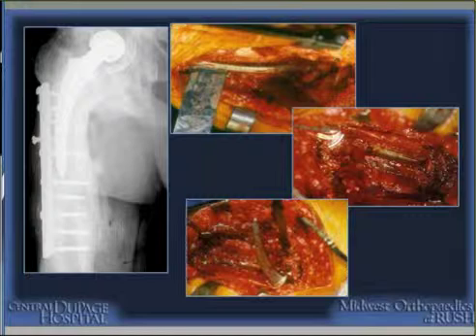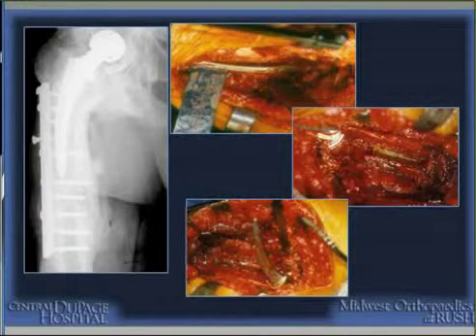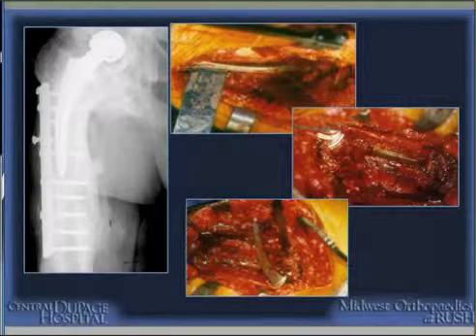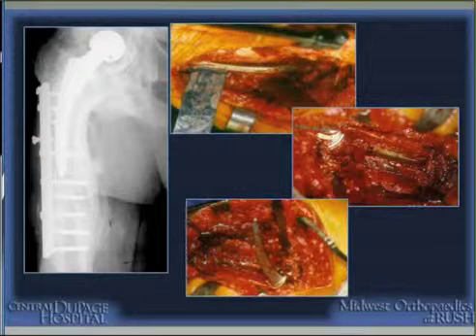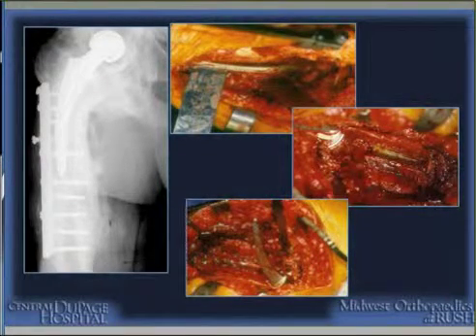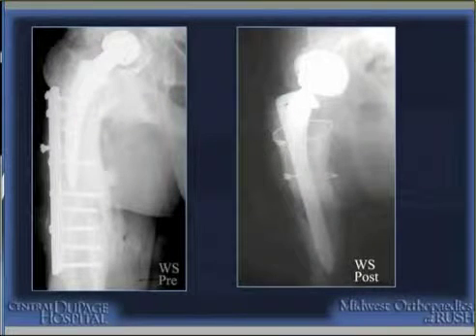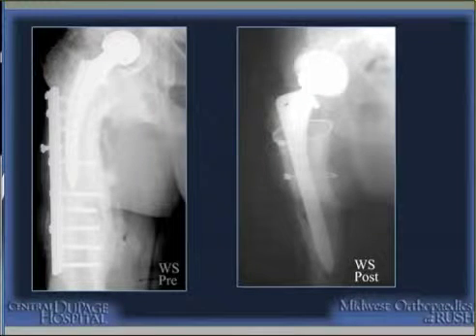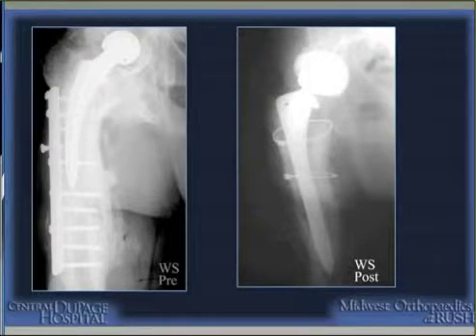You can see in the lower photograph, we've done an extended osteotomy down to the stem tip, pulled the stem out, whether it's a cementless or cemented device, and then we're able to remove the component and dissect around the heterotopic ossification or the severely migrated acetabular component much easier. So I think this is probably the number one usage of an extended osteotomy for difficult acetabular exposure when we're doing an isolated acetabular exposure.